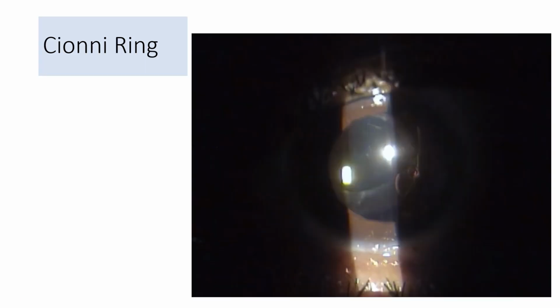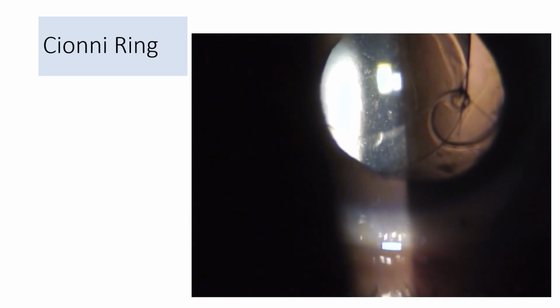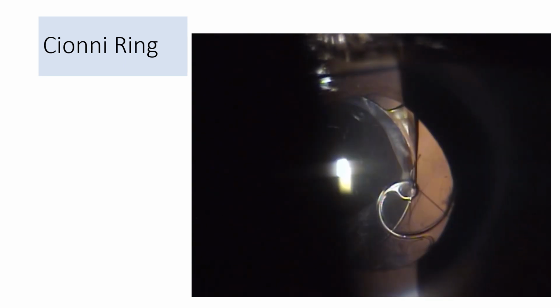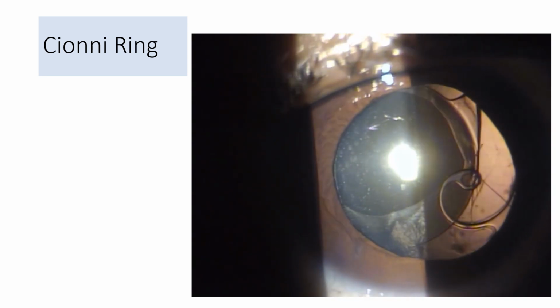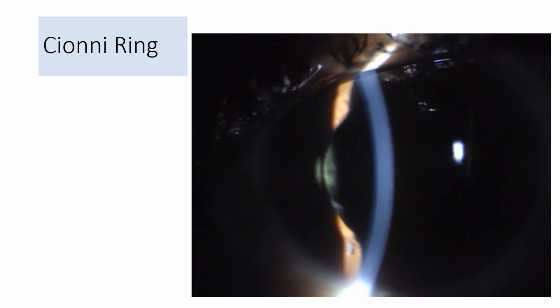This is just to show you that if you've got a significant subluxation which involves more than 6 clock hours, you can put an Ahmed, or rather Cionni, ring. You can see this is a special type of capsular tension ring which has an eyelet which can be sutured to the sclera like a scleral fixation, and thereby you can fixate the capsular bag rather than fixating the IOL. So this is superior to doing a scleral fixation of the IOL, because once the bag is there, there is less tilt of the lens after putting in the intraocular lens compared to a scleral fixation IOL.